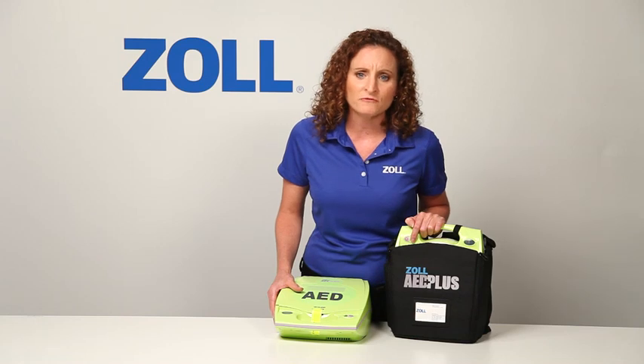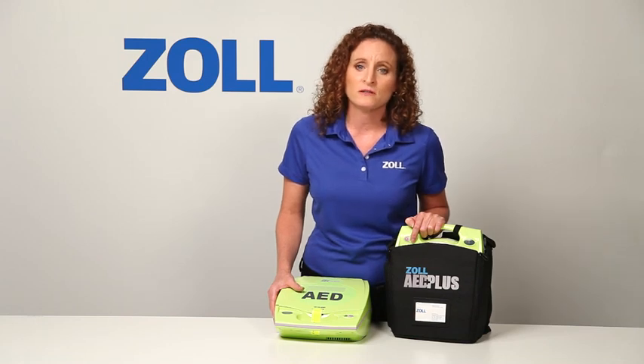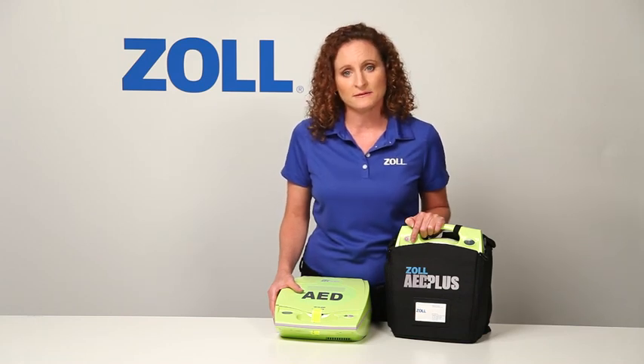The best possible rescuer support, provided only by the AED Plus, means more power in the hands of rescuers. This is one final reason why you should choose Zoll's AED Plus.